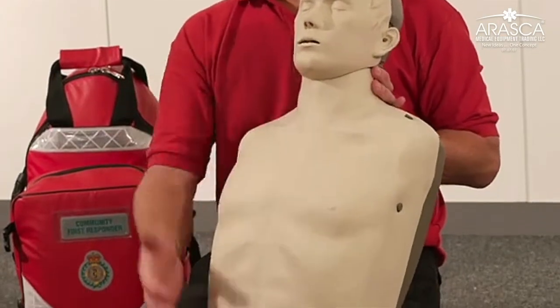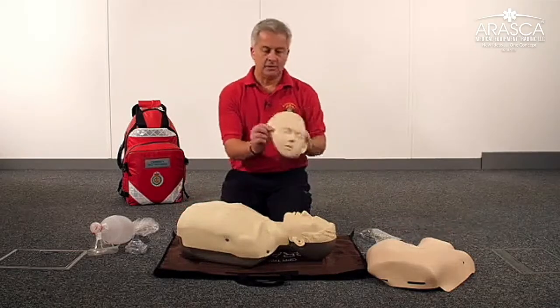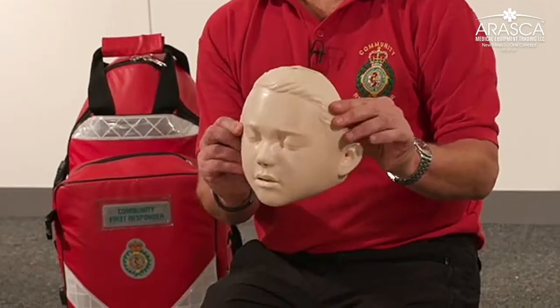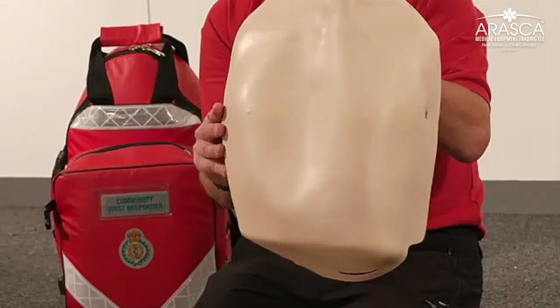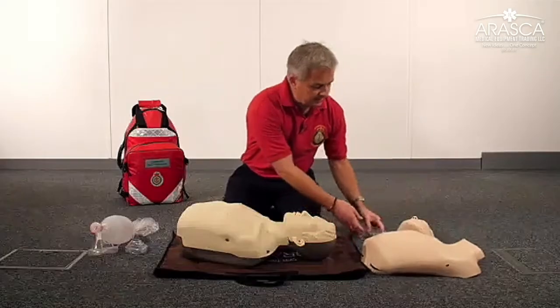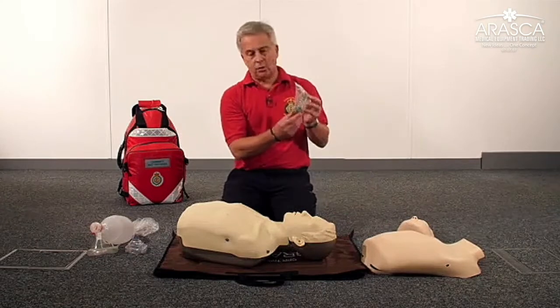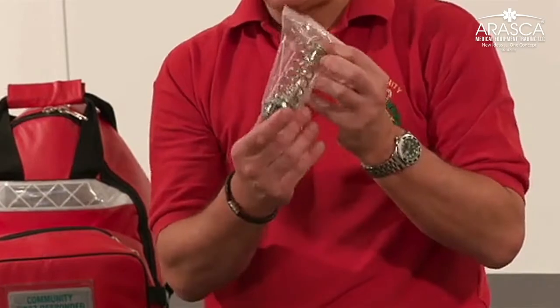The conversion kit has a face skin which represents a 10 to 12 year old boy, a torso chest piece which you can easily put onto the Brayden, and a replacement spring which is more representative of the compliance of the chest of a 10 to 12 year old boy.